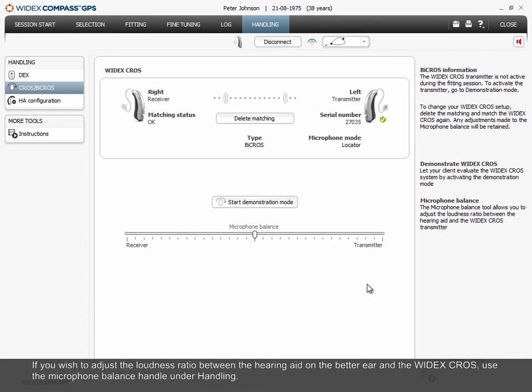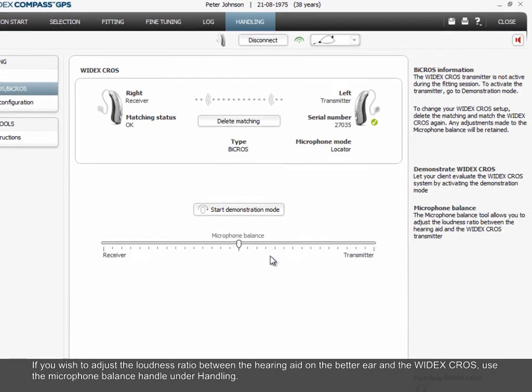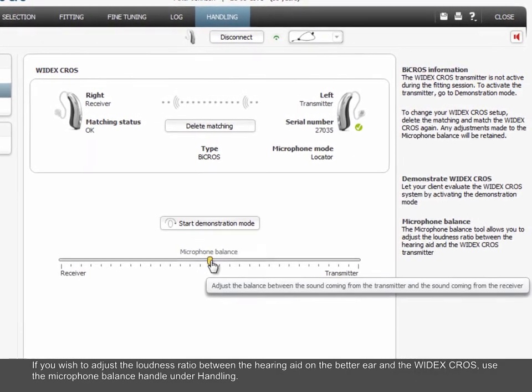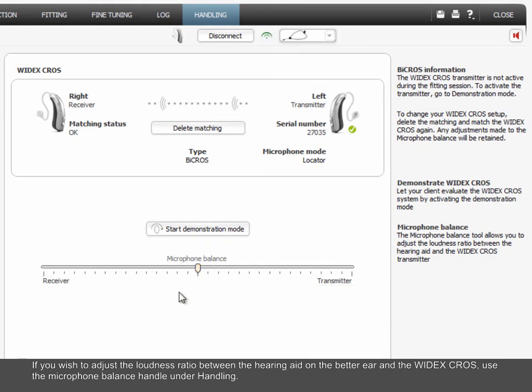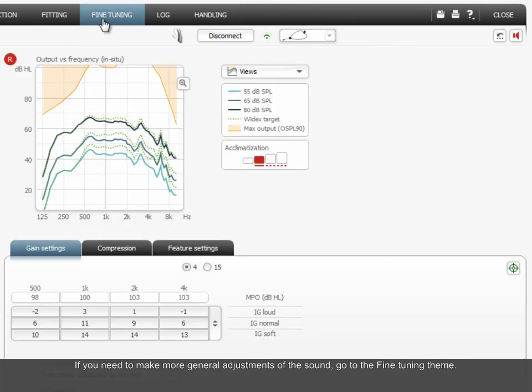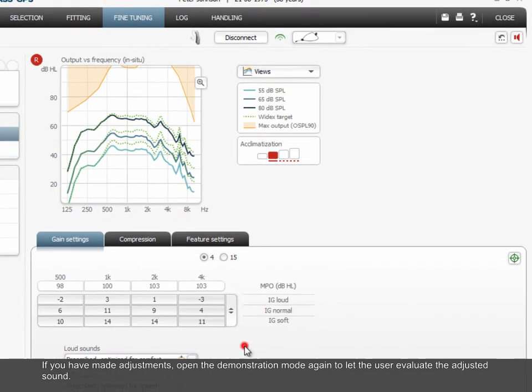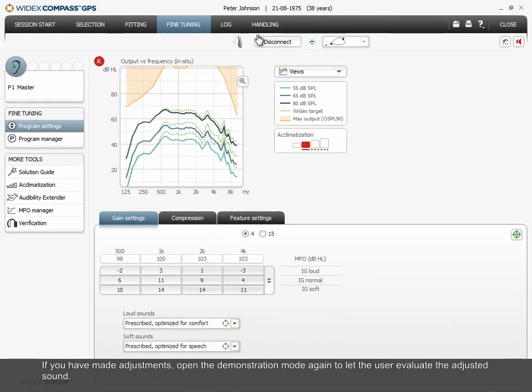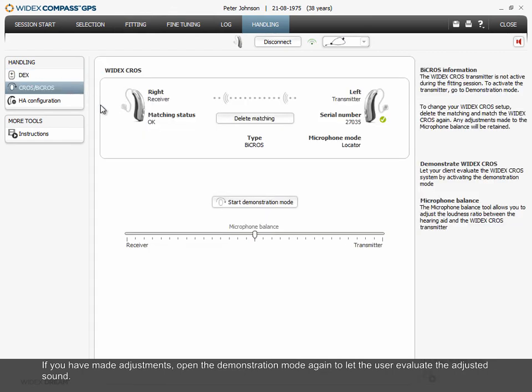If you wish to adjust the loudness ratio between the hearing aid on the better ear and the Widex CROS, use the microphone balance handle under Handling. If you need to make more general adjustments of the sound, go to the Fine Tuning Theme. If you have made adjustments, open the demonstration mode again to let the user evaluate the adjusted sound.